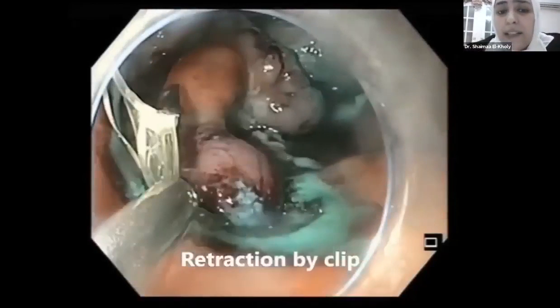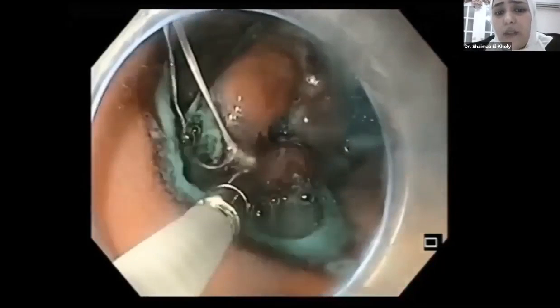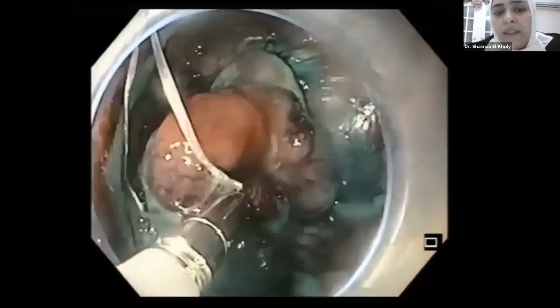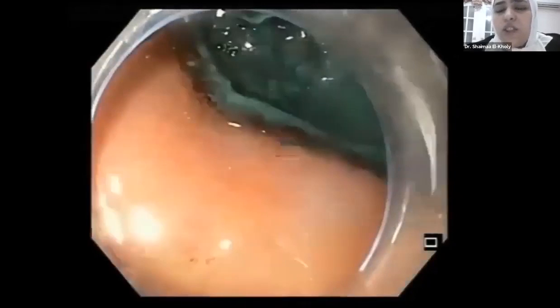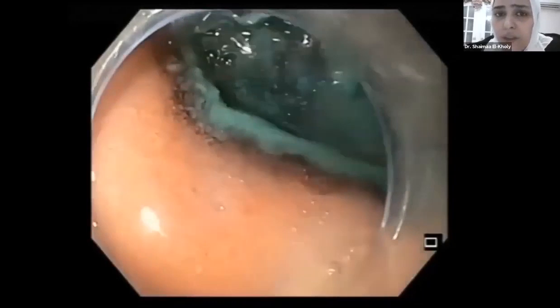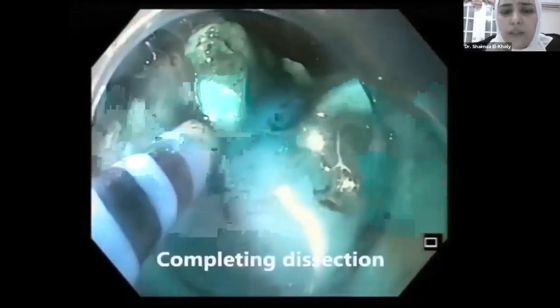And here is a clip retraction method where this is a dental floss that is attached to a clip. And then it is attached to the edge of the lesion. And you let your assistant gently pull the dental floss, just forming a flap for you so that you can go down and complete your dissection.